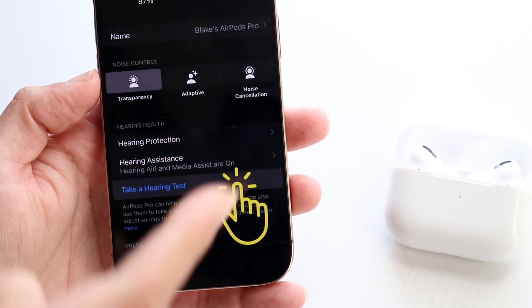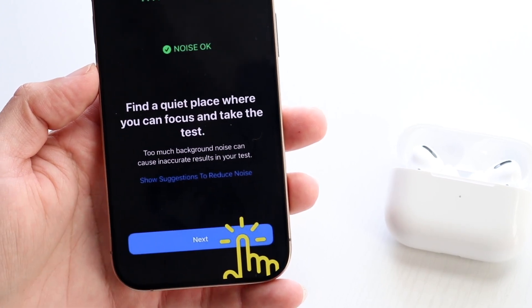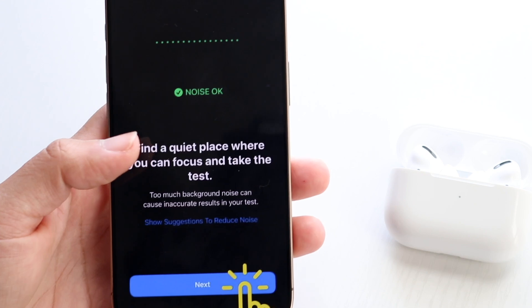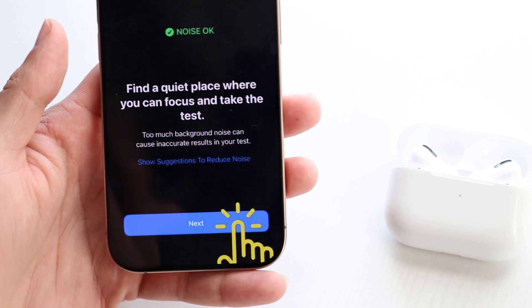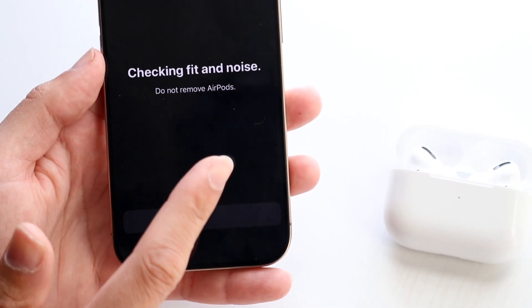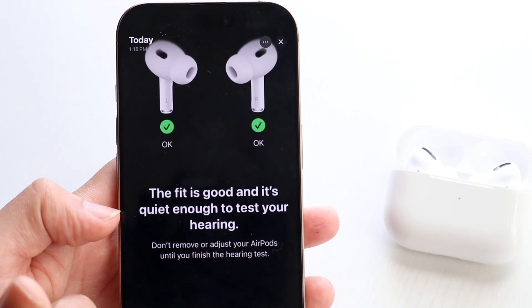Make sure those AirPods are in your ear while doing the test. It will walk you through on-screen instructions. Make sure the AirPods are in your ear, then follow the instructions and tap Next. It's going to check for fit, noise, and all that stuff. It'll go through a bunch of things and then give you a thumbs up, telling you the fit is good.